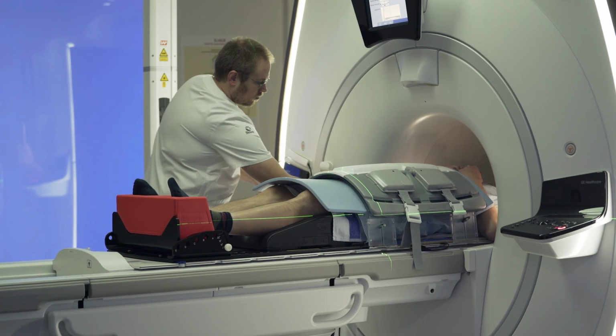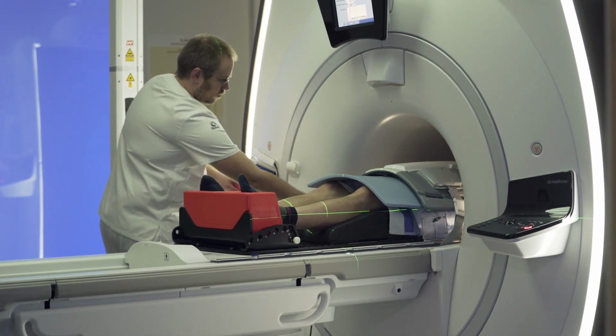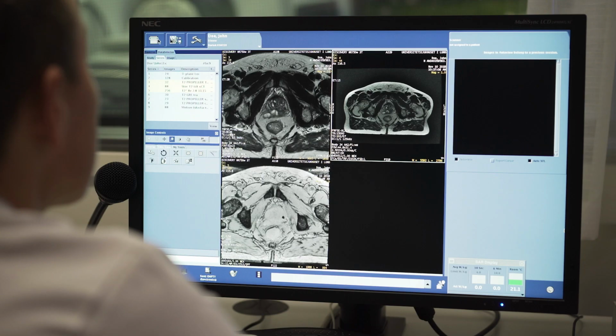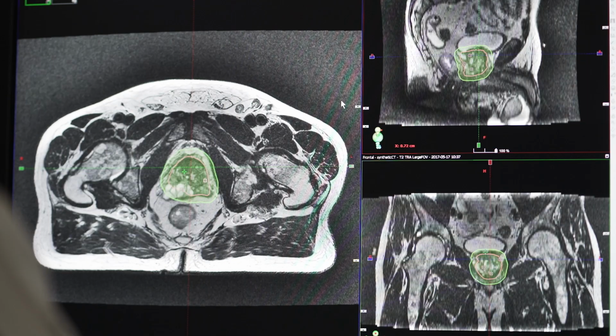The hospitals in the Swedish Gentle Radiotherapy Consortium started to use MRI about 5 to 10 years ago. That was a huge step forward, as we could make use of the superior soft tissue contrast when defining the extent of the tumor. In the combined CT and MRI workflow, you have to align the two images as accurately as possible, since they are taken at two different occasions.